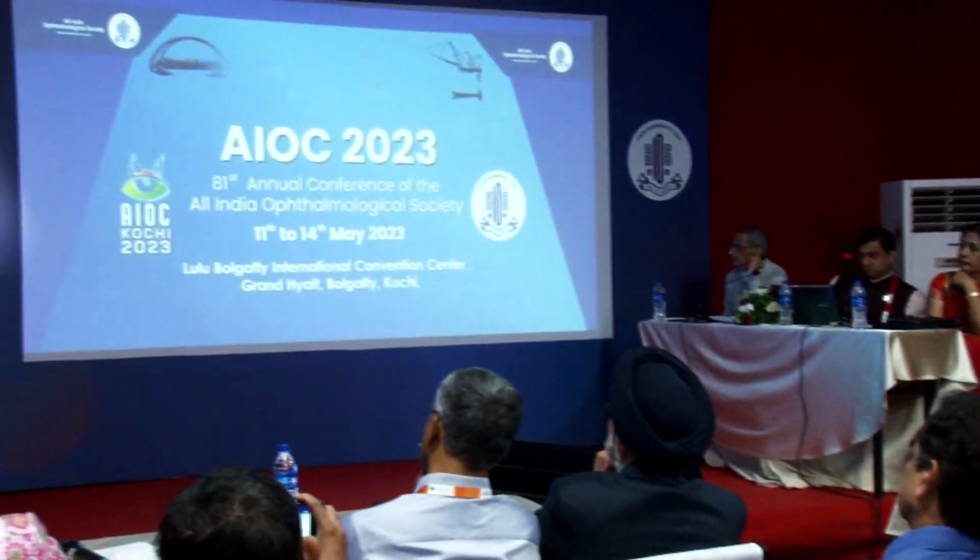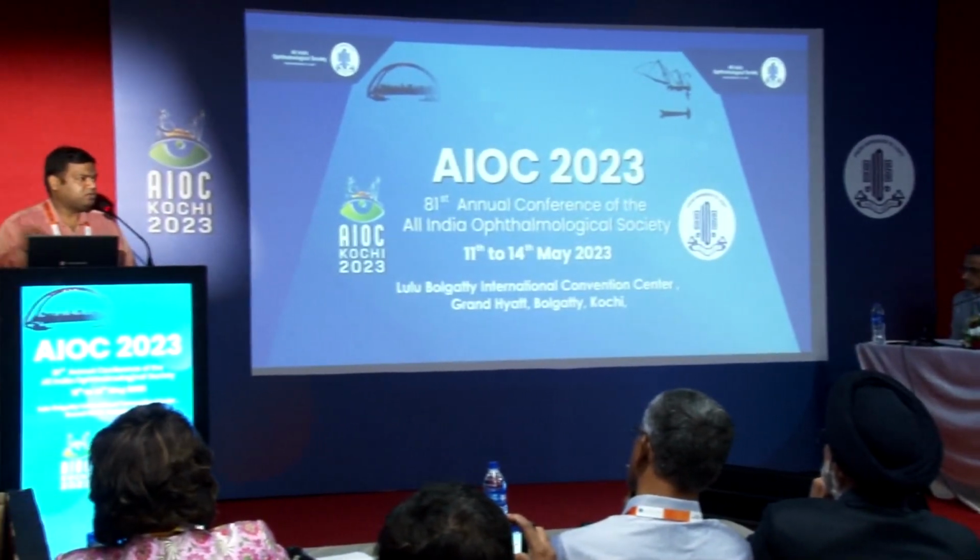So what I did was that in the OCTs, when the vascular arcades are scanned, we can see the vessels on the OCT scan. So in a few of the OCTs, I could see the vascular arcades in my scan with the glasses. But without the glasses, when I'm doing the scan, I could not see the vascular arcades in the OCT scan. That's exactly what I'm saying.